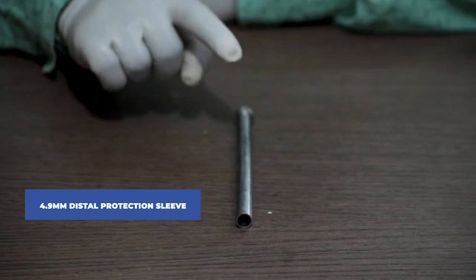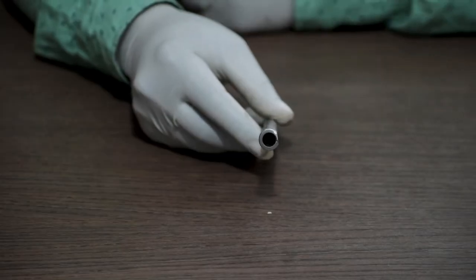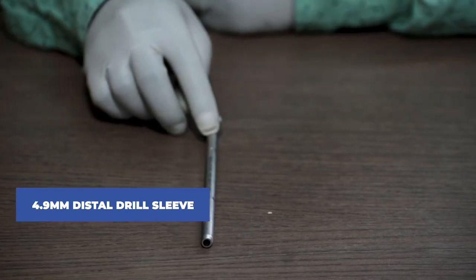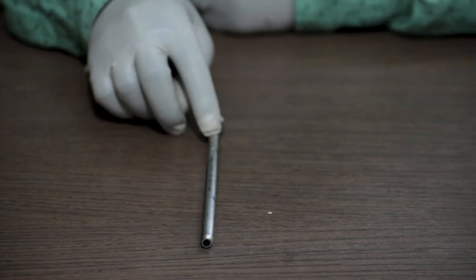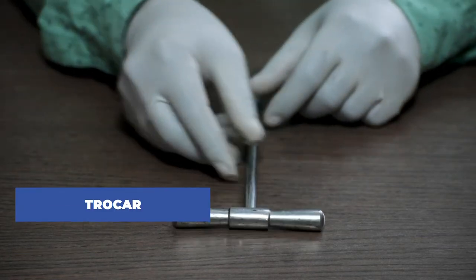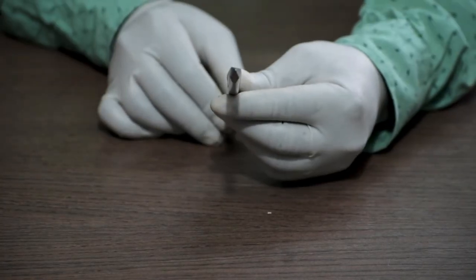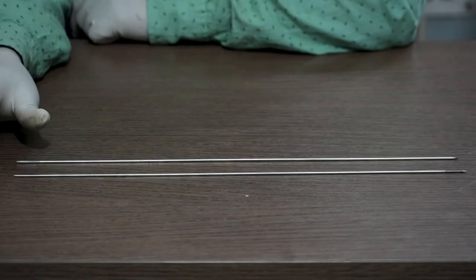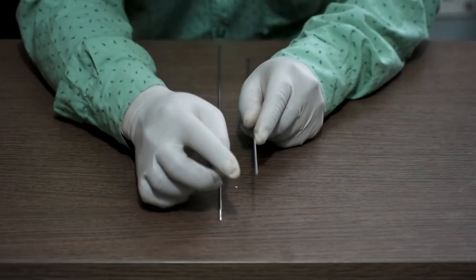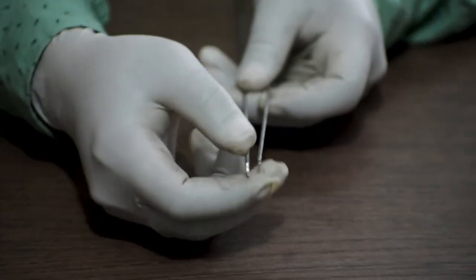Next, 4.9 mm distal protection sleeve. Next, 4.9 mm distal drill sleeve. This is called a trocar. Next, 2 mm guide wire and 2 mm guide pin. You can differentiate between the two with the availability of the thread. The threaded one is the guide wire and the normal one is the guide pin.